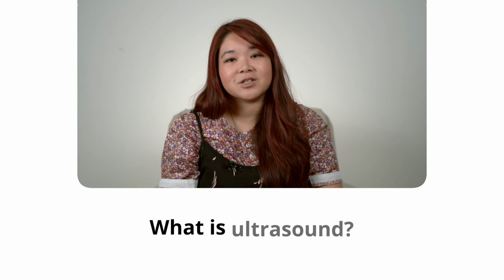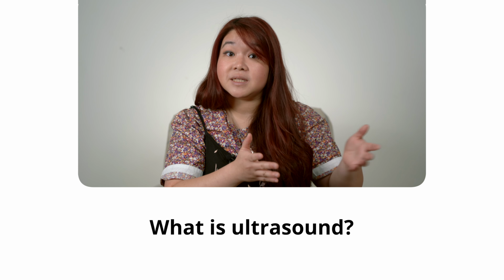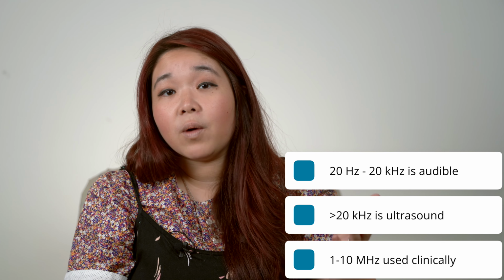So first things first, what is ultrasound? In Latin, ultra means above, so ultrasound is above sound, and this is because it's above the range of human hearing. We can hear between 20 Hz to 20 kHz, so any sound waves above 20 kHz are ultrasound. The machines that you've seen in clinical use will work via sound waves in the range of about 1 to 10 MHz. That's pretty big.